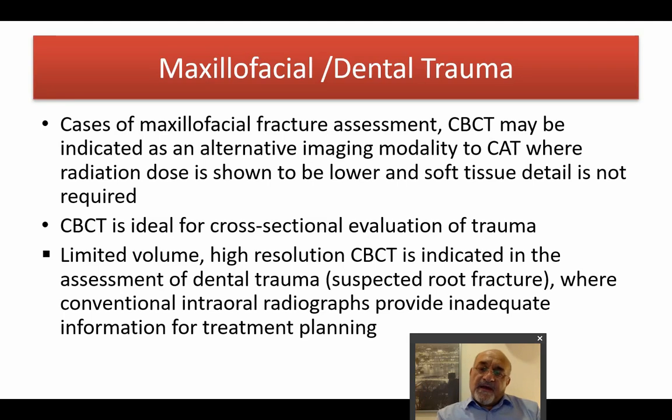The reason why we will go for CBCT in cases of trauma is that 2D radiographs, all 2D radiographs, starting from the periapicals ending with the largest, like posterior anterior skull or whatever, are two-dimensional and you lack the depth.